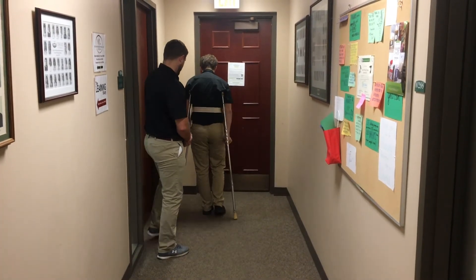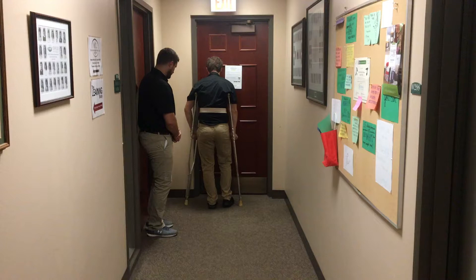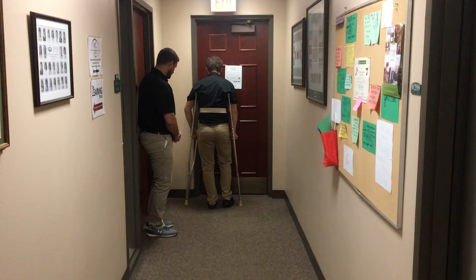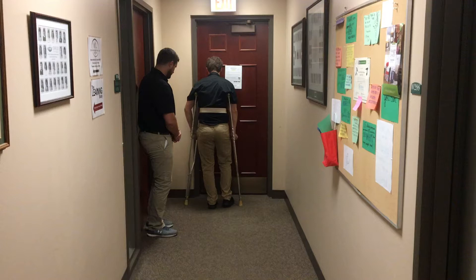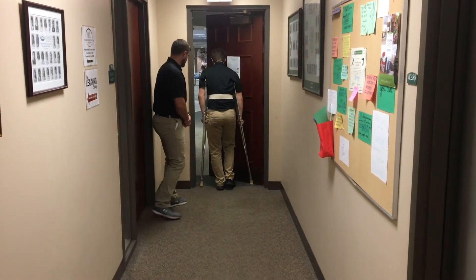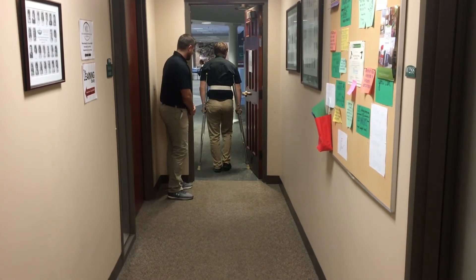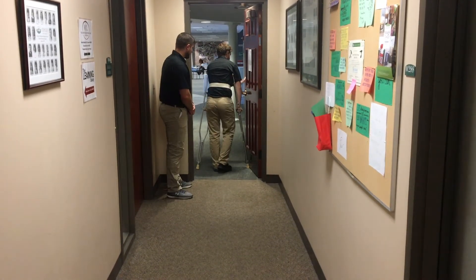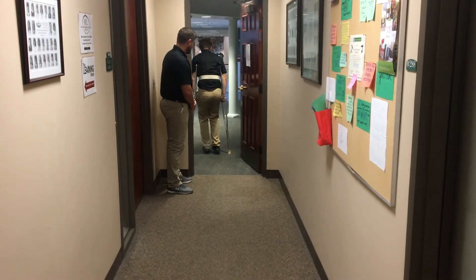Instruct the patient to stand directly in front of the door and have the patient shift their weight to the crutch opposite of the hand closest to the door handle. With their free hand, the patient will push the door open wider than the width of the patient and the crutches. The patient will quickly return their hand to the crutch and use the crutch closest to the door as the doorstop. The patient will then repeat this process to move the door open wider and progressively move the doorstop crutch towards the handle side of the door. The patient may use one final push when the crutch tip nears the end of the door in order to avoid the door's swing arc.